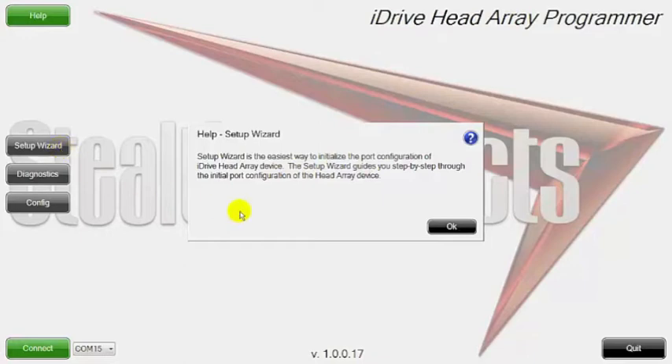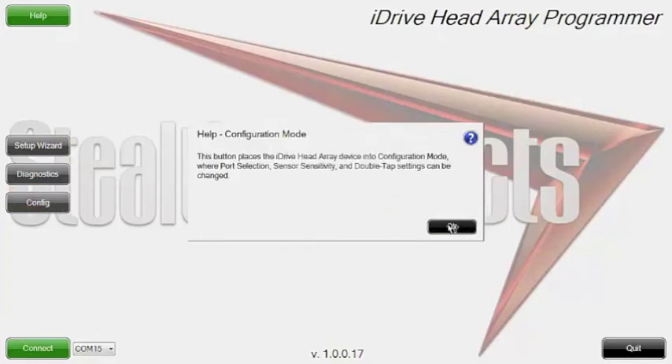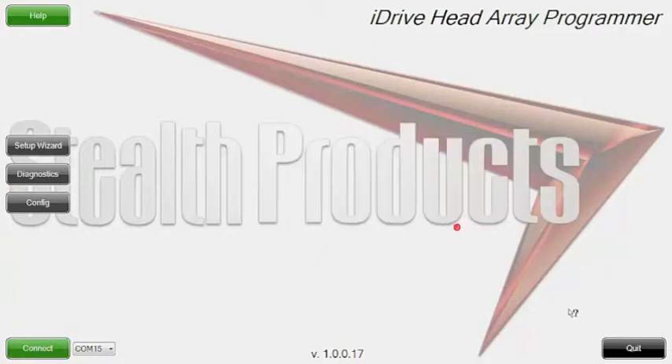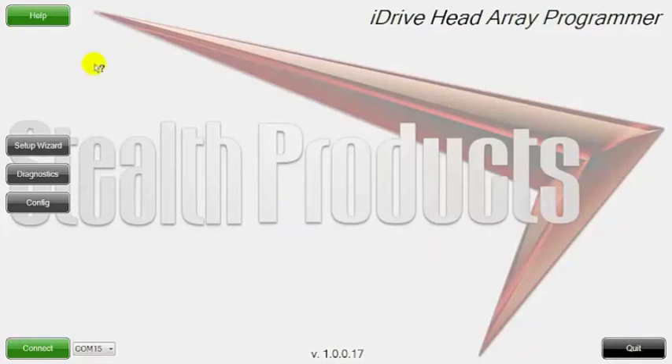So you can see here it's talking about the setup wizard, diagnostic mode, configuration, from connecting, and also what the quit button does.